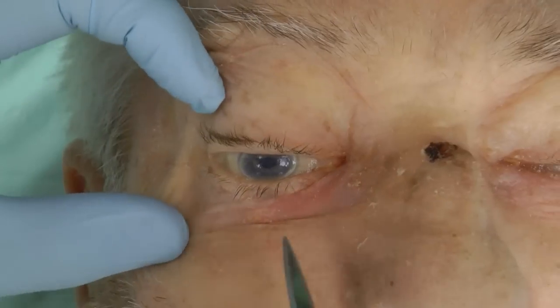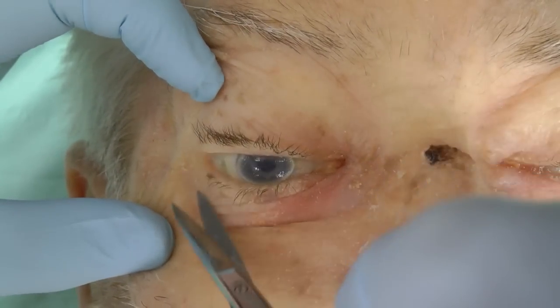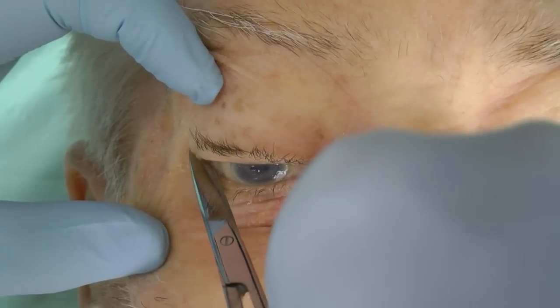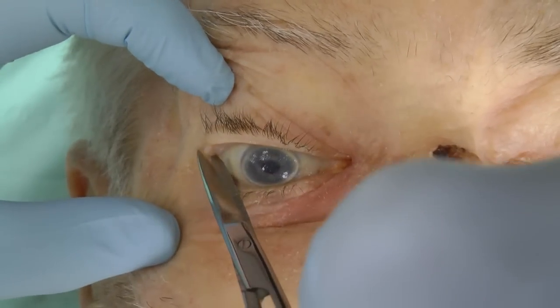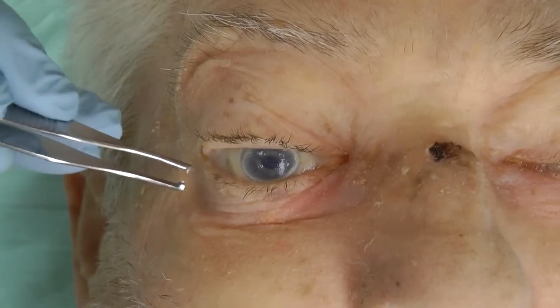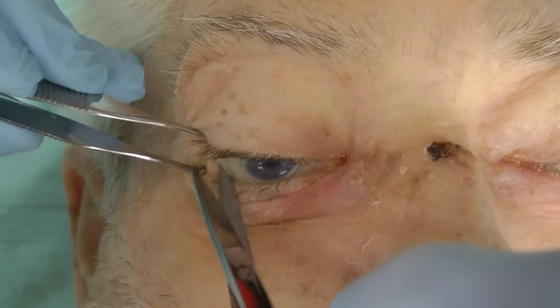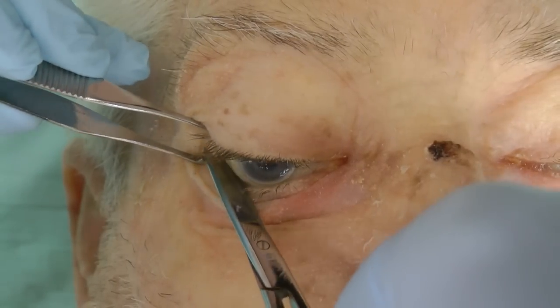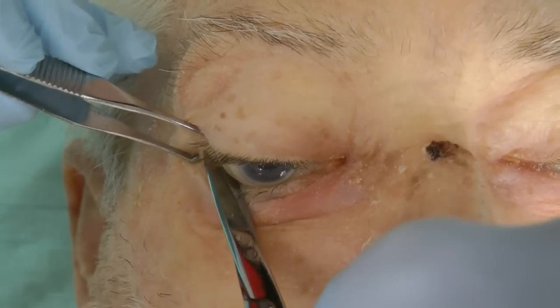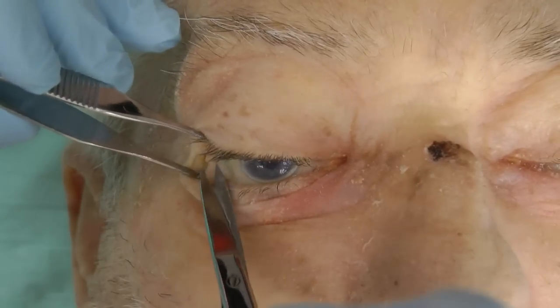The canthus is incised and the incision is extended to the orbital rim. The lower lid is pulled down and away from the eyelid, and the inferior crus of the canthal ligament is cut.